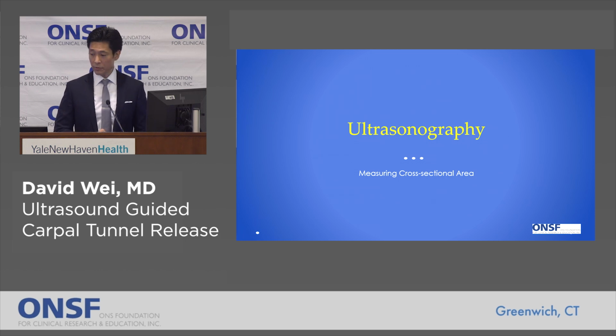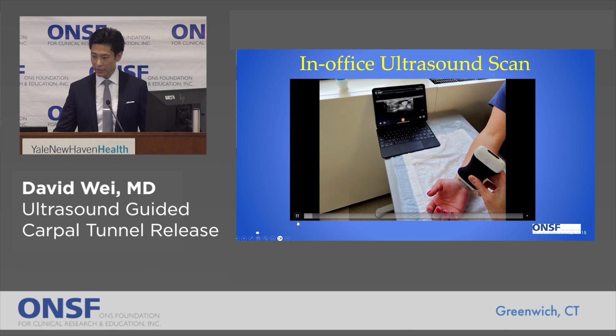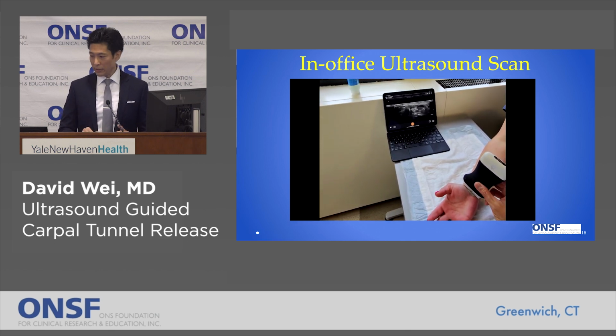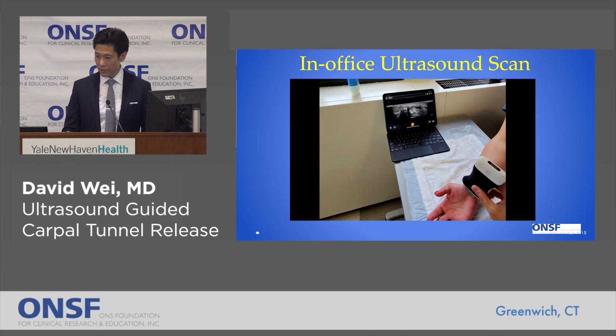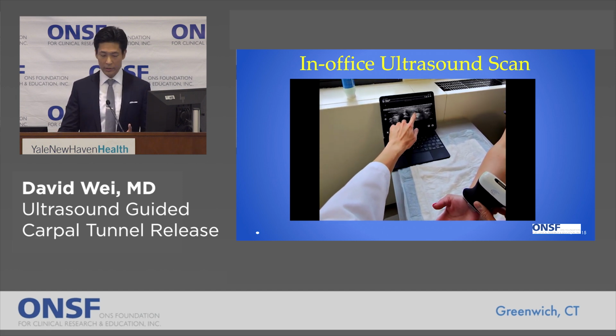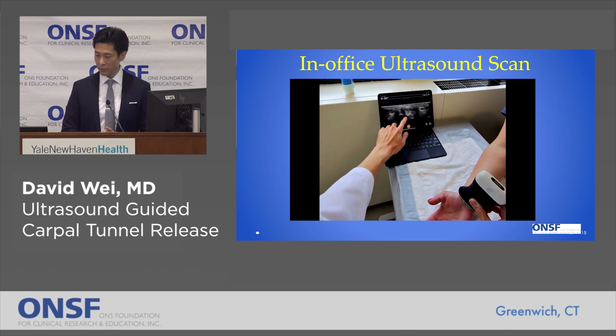Ultrasonography has changed this for my practice, and the reason is it lets you see the nerve immediately when you come to our office. So let me see if I can play this video. This is a video of me using the device that I would use every day for you if you have carpal tunnel. You come in and I'm holding this portable ultrasound device and it's connected wirelessly to my iPad. I'm scanning a wrist and I'm pointing out to this patient that I could see their nerve.